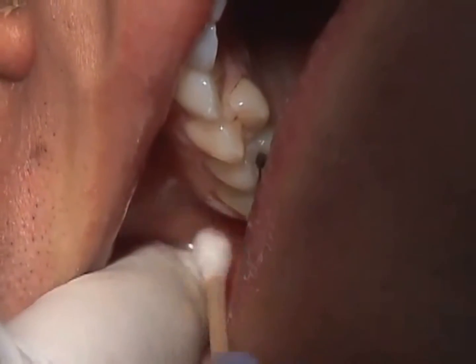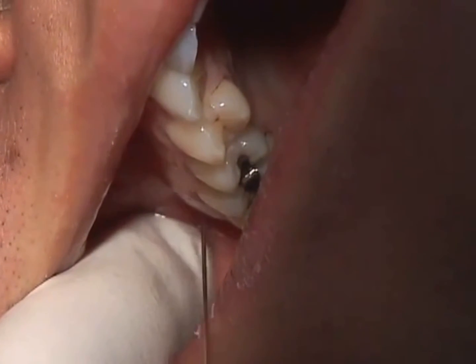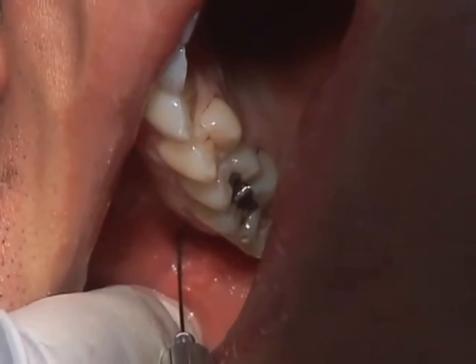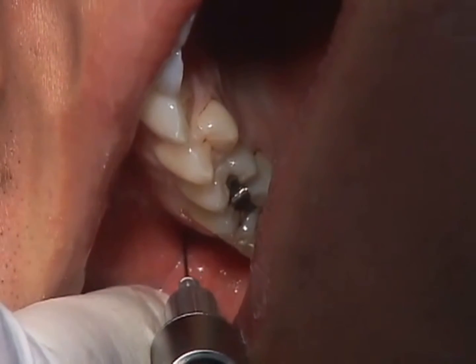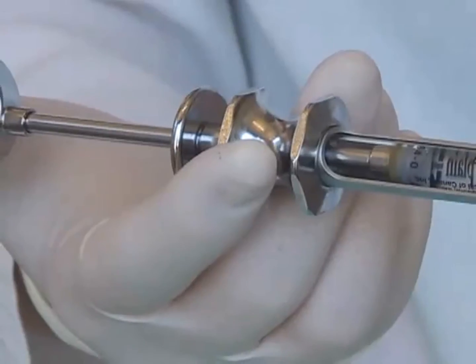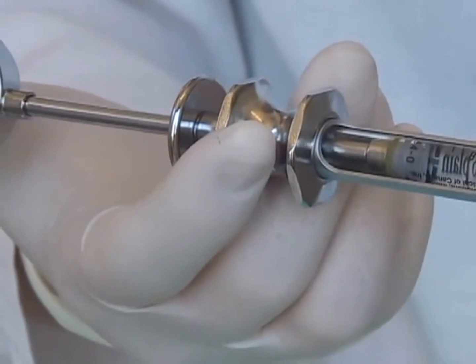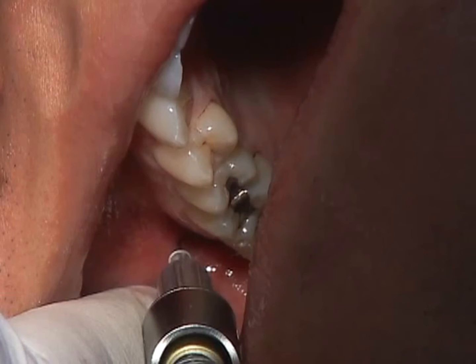Firmly retract the soft tissue until taut and the insertion site is visible. Insert the needle and advance approximately 16 millimeters. No bony contact is made. This region of the maxilla is highly vascular. As an extra precaution, multiple aspirations should be performed prior to depositing any anesthetic solution. Roll the barrel with the fingers to change the orientation of the needle bevel before each aspiration. If there is no evidence of blood in the cartridge after 3 aspirations, you may proceed to deposit the solution.